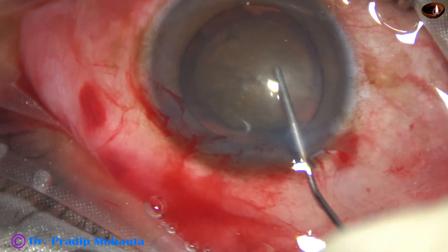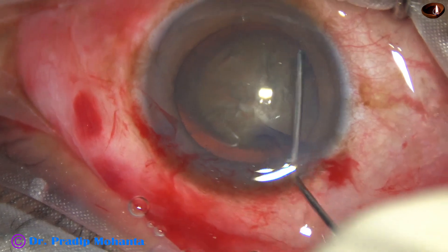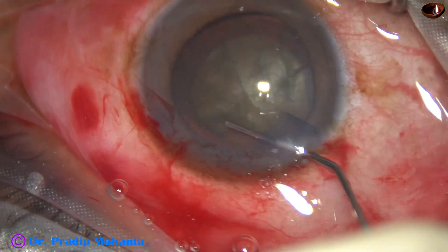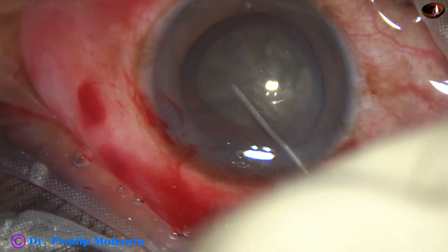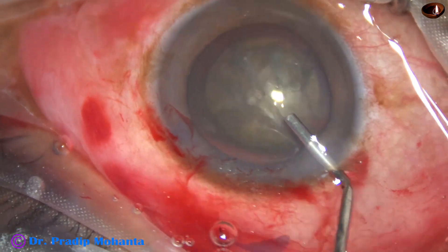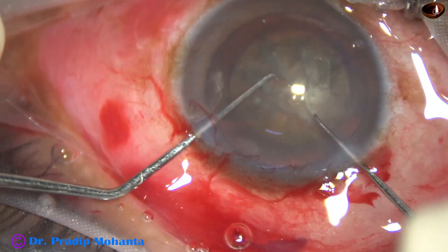Hydrodissection is done at multiple points with BSS. The nucleus is tapped gently. In such cases, the rotation should be bimanual, as rotation with only one hook causes more zonular stress.